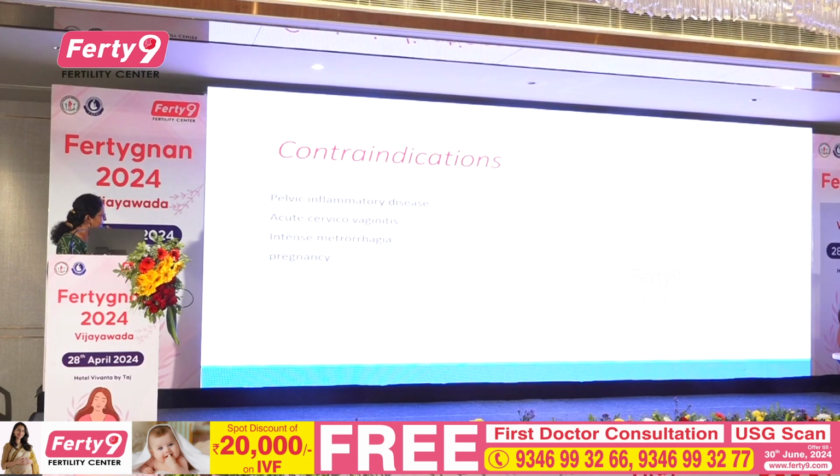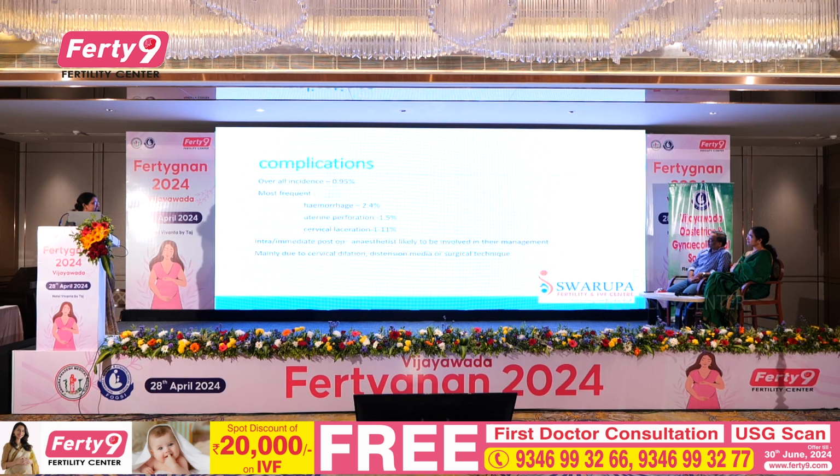What are the contraindications? Pelvic inflammatory disease, acute cervicovaginitis, intense metrorrhagia, and pregnancy. And here come the complications. Overall incidence of hysteroscopy complications is just 0.95%. So definitely we all can start doing level 1 hysteroscopies with the minimum setup we have.